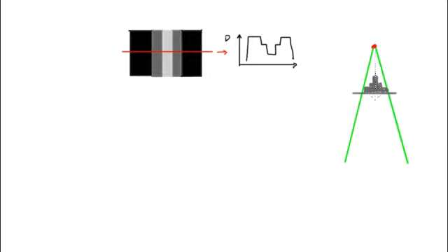So a beam ray going through the middle will be attenuated a lot because of the thickness, less in the outer edges, and so on. And you can design the compensator to deliver whatever fluence map you want. Of course, this is a three-dimensional object. You can modulate in both dimensions, and it has a very high resolution compared to MLC.